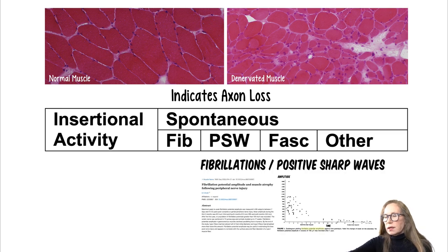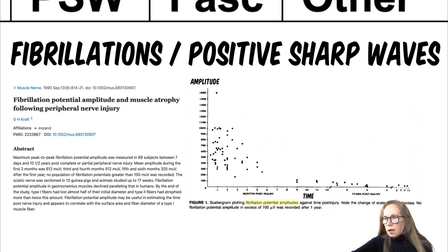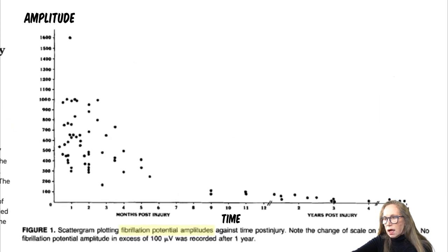So here we've got a study where we're looking at the over time, and on the x-axis you can see the time going from time 0 all the way out to the 1 year, just above the time point, and then way over to the side, even longer than that.